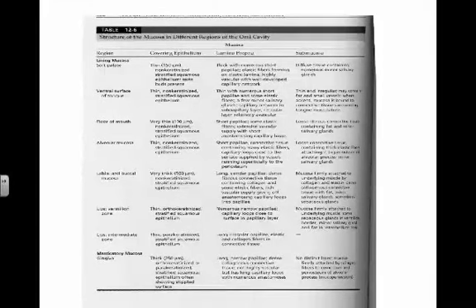Okay, so go through the areas, the floor of the mouth, very thin epithelium. It has short papillae. It does have some fibrous connective tissue and minor glands. The lining, the soft palate, has thin epithelium. It's got lamina propria, and it has some salivary glands. The alveolar mucosa is thin, non-keratinized epithelium with short papillae, short rete pegs, and it does have a submucosa.